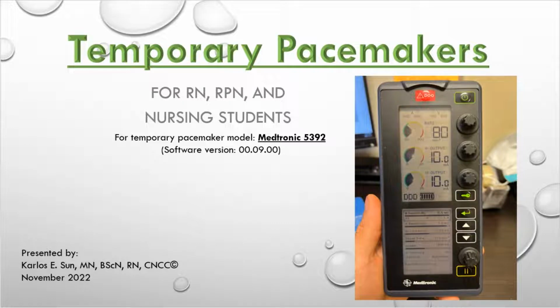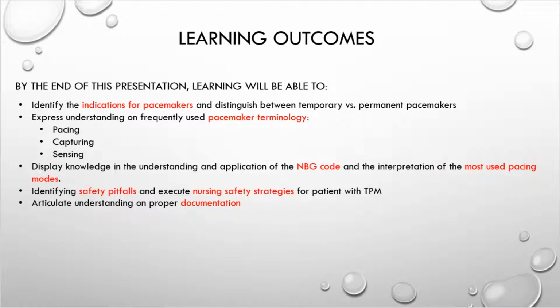In today's video, we're going to go over temporary pacemakers, and this is intended to be a guide for nurses and nursing students. The pacemaker model that we'll be using in our discussion is the Medtronic 5392 with the software version 00.09.00.